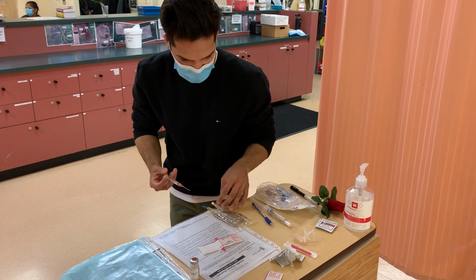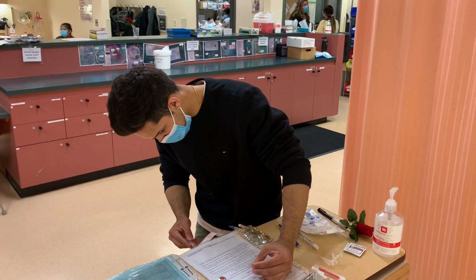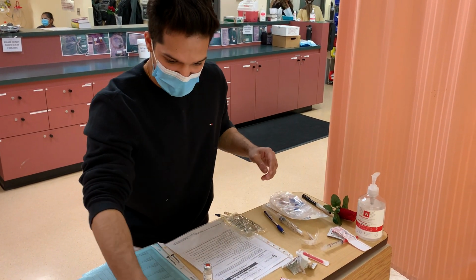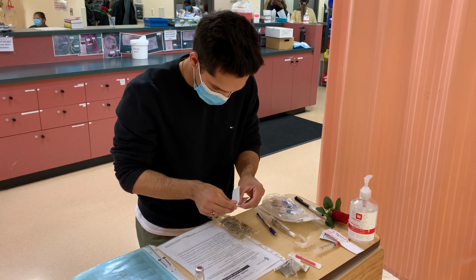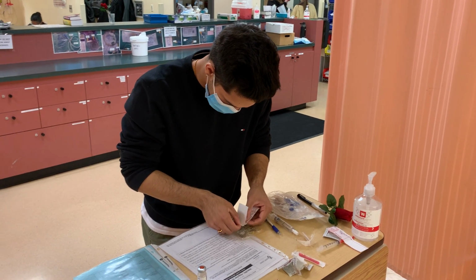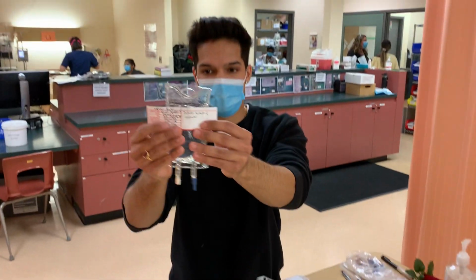Okay, once I've injected it in there, I'm just going to scoop this. Now this can go into the sharps, and then I won't be using that. And then first thing I'll be doing is just labeling my bag. My final labels, and then these can both go into the sharps. So now that I've done that, I'm labeling my bag. Here's my label for my bag.